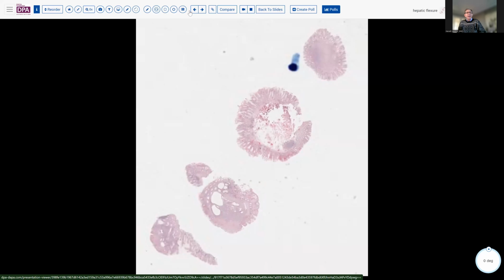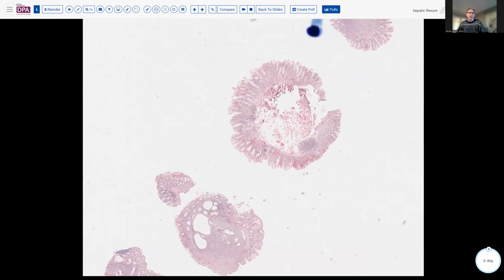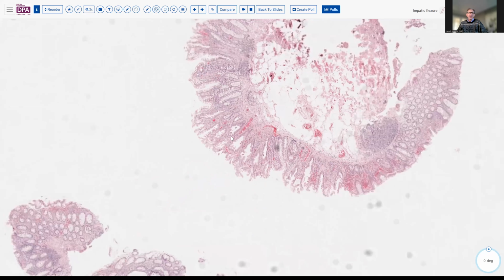In our particular patient, GI endoscopy was performed, leading to the production of a couple of biopsies. And as we note here, there's one more conventional polypoid lesion with serrated architecture, compatible with either a hyperplastic or serrated polyp.